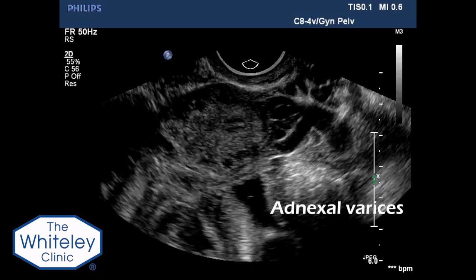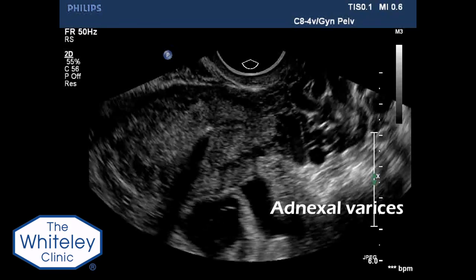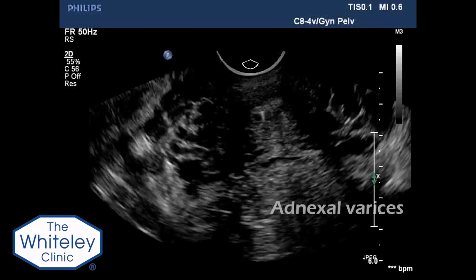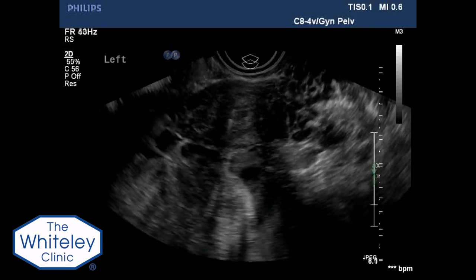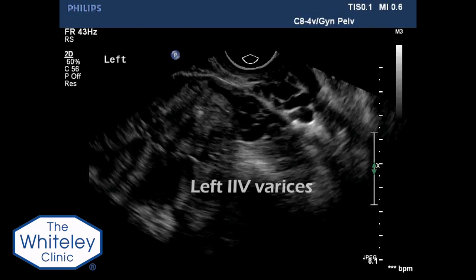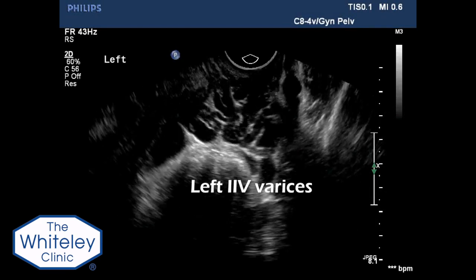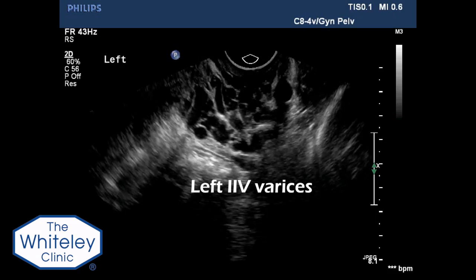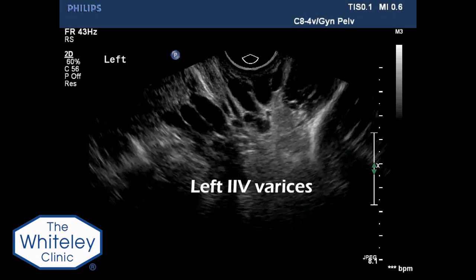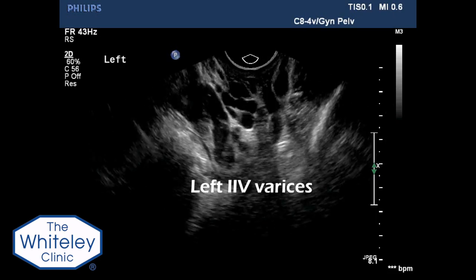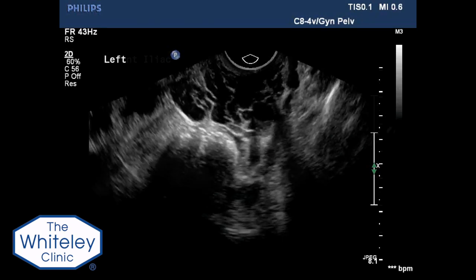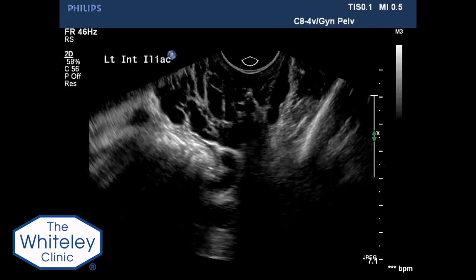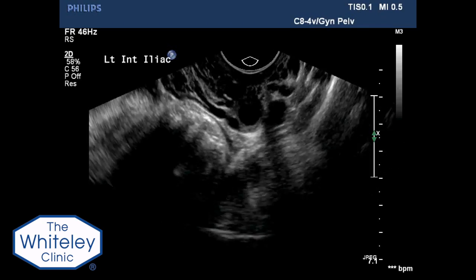The transducer is rotated through 90 degrees to obtain a coronal view. Note the varices lying to the right and left of the uterus. The transducer is angled into the left lateral fornix where the left internal iliac vein can be seen adjacent to the lateral side wall of the pelvis, with varices lying medially.